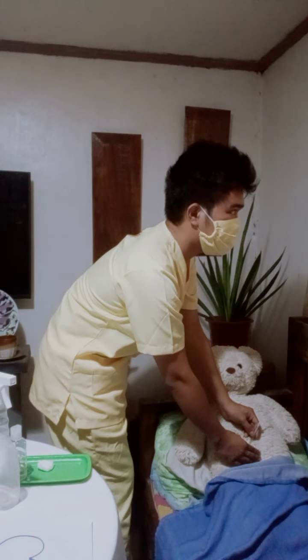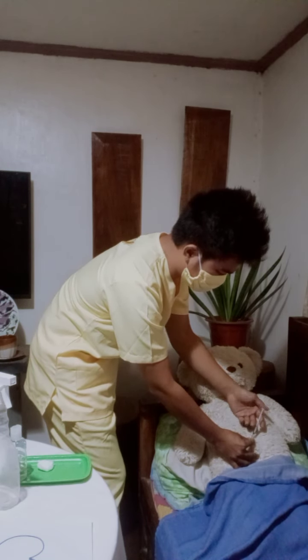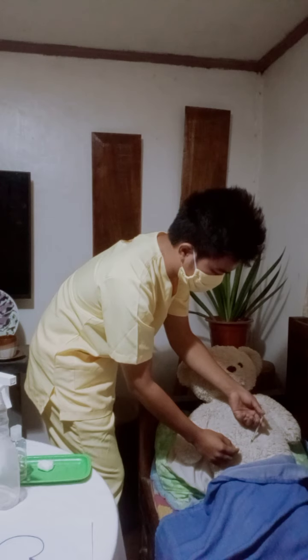While holding it on the skin, we're going to introduce or inject the drug.